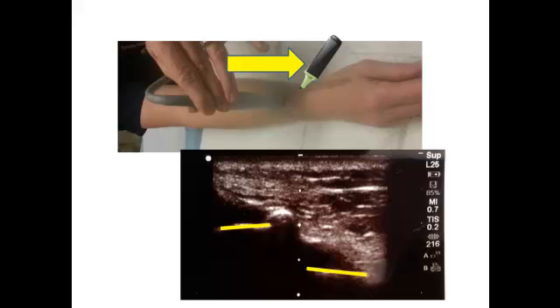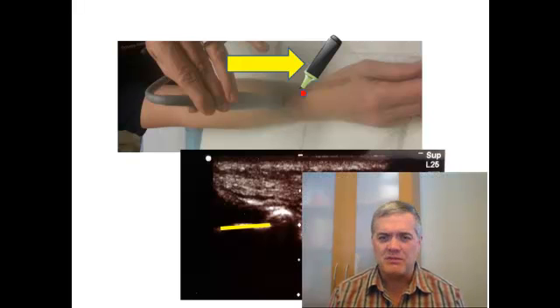Now all you're going to do is take your surgical marker — I've got a picture of a highlighter here, but it'll do — and put a little dot. You'll notice there's a set of dotted lines going up from the ultrasound image; that's the center of your probe, and that's where you put that dot. Using a surgical marker or an industrial Sharpie, that mark should stay there. You can then use that to site your hematoma block. Using this method I've never missed, and it gives better analgesia for the patient. I hope this works as well for you as it has for me. Good luck. Happy Ultrasounding.